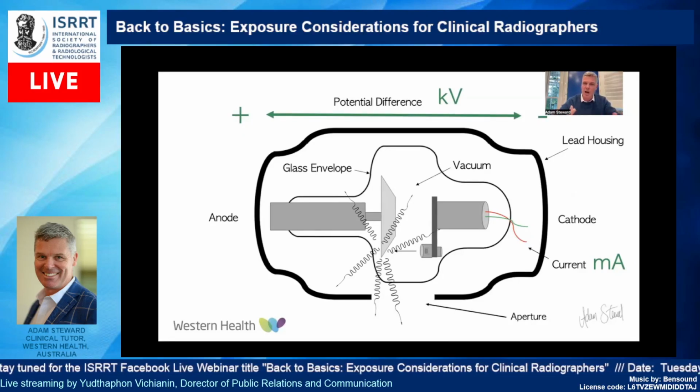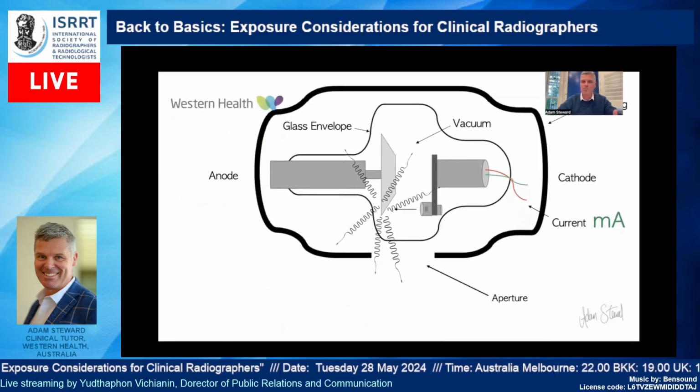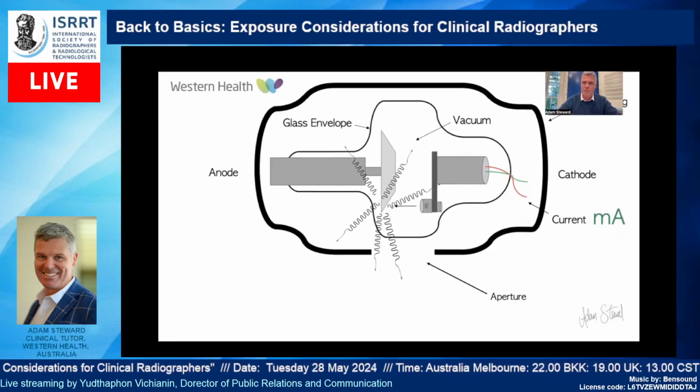So you can imagine the overwhelming heat, because for every photon there's 99 elements of heat produced, and likewise, to produce one we're going to use, there might be thousands that we're not going to use. That's why we have lots of measures to try and reduce the heat to the tube, and that includes immersing it in oil and so forth, okay?